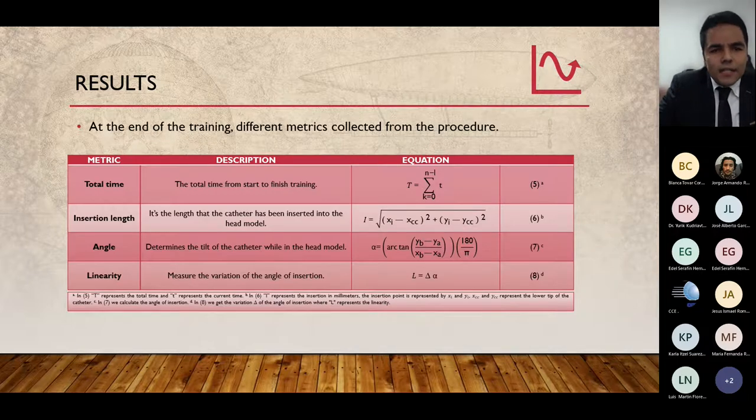At the end of the training, different metrics are collected from the procedure, such as total time, insertion length, angle, and linearity. In this table, we can observe the equation of each metric.